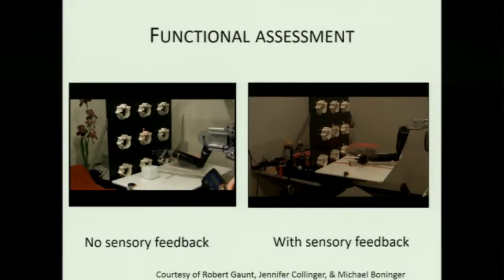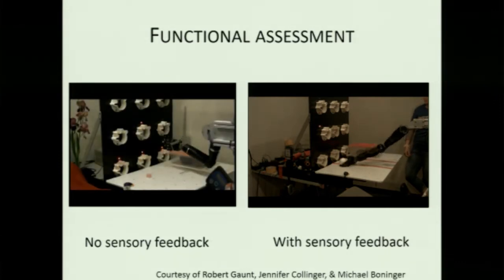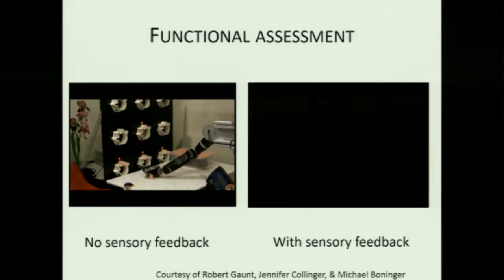And I'll just end with this slide here. So this is Jan. This is Nathan. And so not only has the sensory helped to make these, but you can also see that Nathan is better at this, not because he's intrinsically better than Jan, but because these motor decoding algorithms have been improving steadily over time, and I think that kind of shows in these videos here.